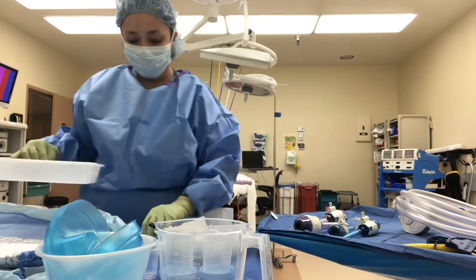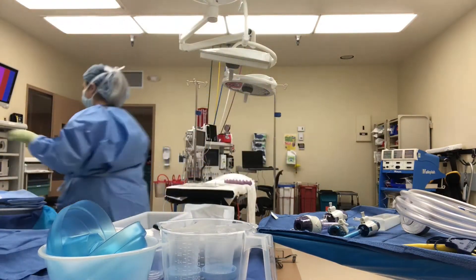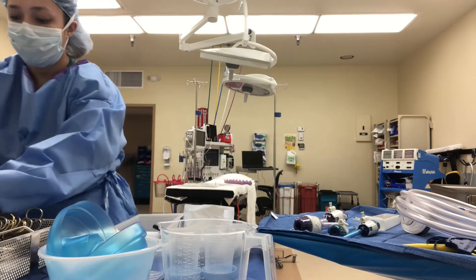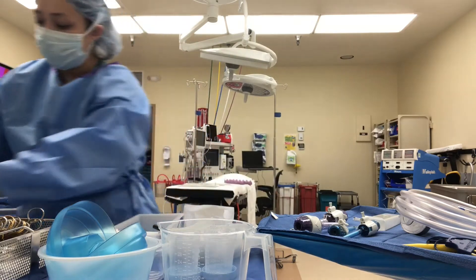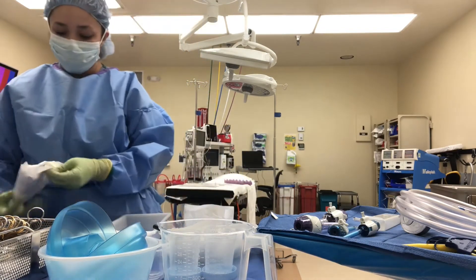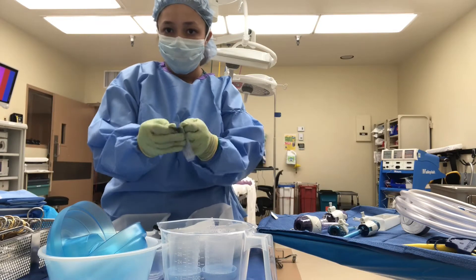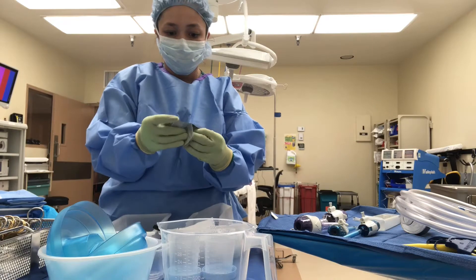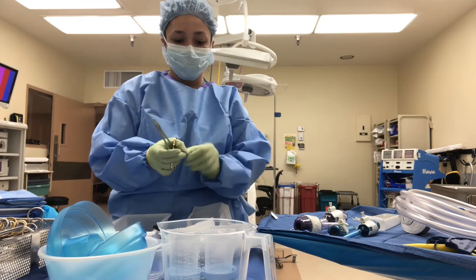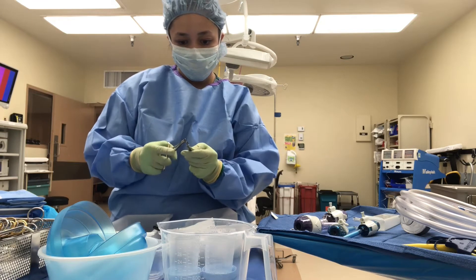Now I'm getting everything organized to bring my instruments up to my back table. I first reinforce the back table with the towel as I did with the Mayo stand, then bring my instruments over. Before we open the case, we check the sterile indicators — if it's black, it means it was processed. I'm taking out my forceps and knife handles from the pouch. I'm now opening up an 11 blade, which is the blade most often used for laparoscopic procedures. If they are not using the 11 blade, they will use a 15 blade. Here I show you how to put the 11 blade onto a knife handle with a needle holder, and then how to put a 15 blade onto a knife handle with just your hands.